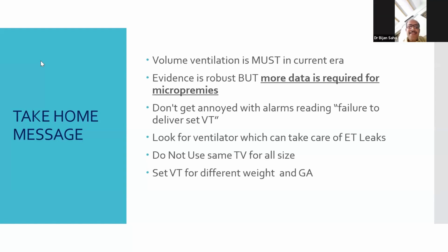Dr. Ashish, you are right, but some ventilators like the VN 600 series claim that 90% leak can be compensated. Yeah, that's right. And we have the VN 600 series. You have shown the VN series also in your presentation.